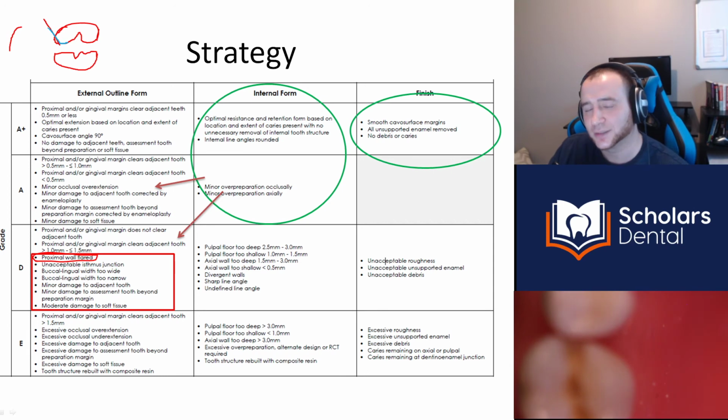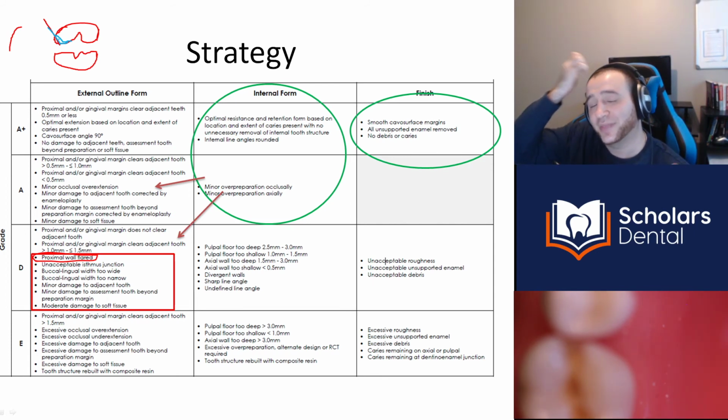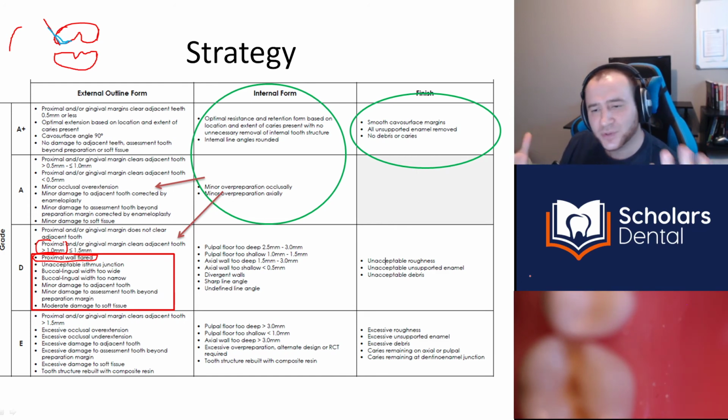Now, if I go correct it, I'm going to have to dig a little bit into here. So I'm going to have to create a bigger S curve and go like this to make it a 90. Now, that may open my clearance, right? It may open my clearance. But here's how I think. That's fine. Why? Because it's in the same column. If I already got a D in the column, why are you fixing one D just to get another D in the same column? Okay, so you might not need to fix that flare, right? If you could get it 90 without sacrificing another thing, that's fine.